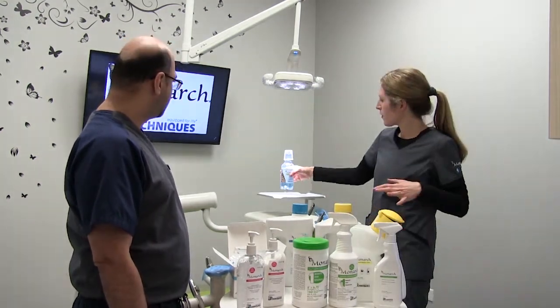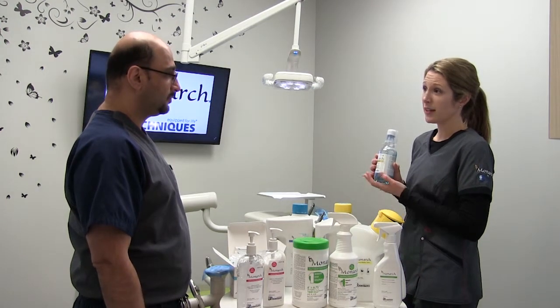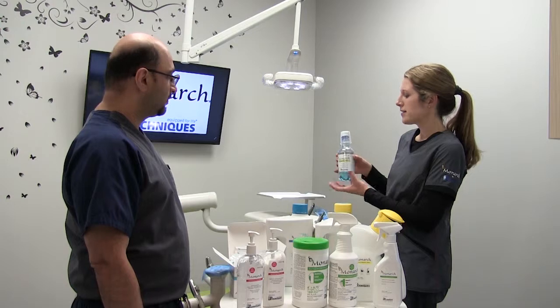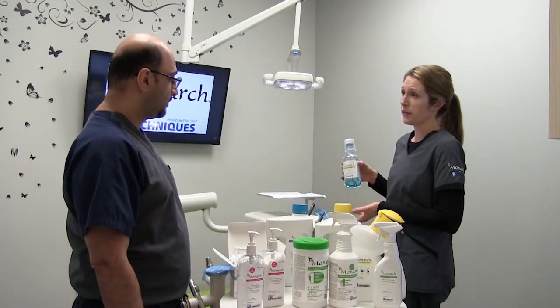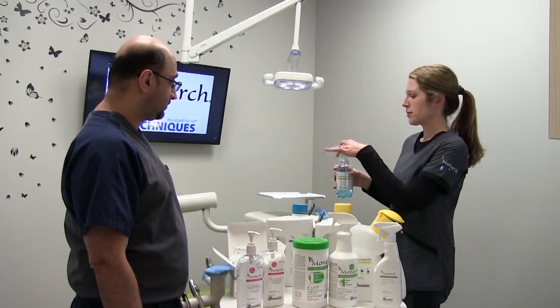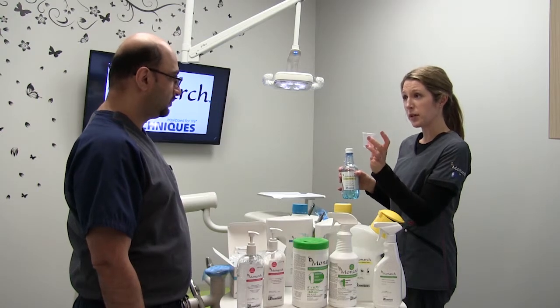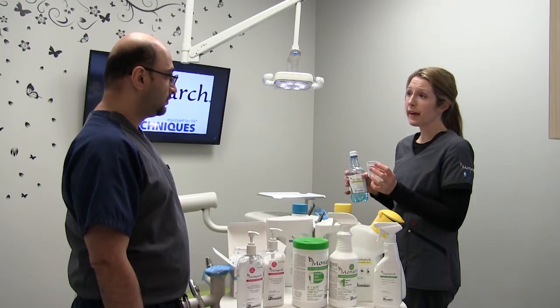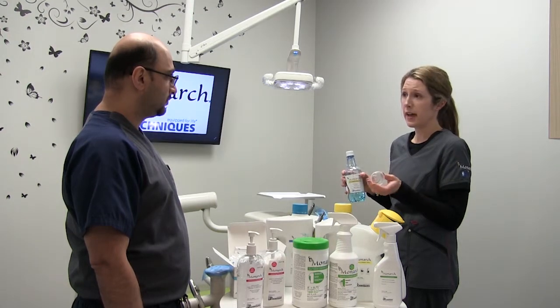For our water lines we have our Monarch water lines cleaner. It was Dental Advisor's 2019 product of the year. It safely and effectively cleans all the biofilm out of your water lines. It's very easy to use — it comes with a measuring cap, and only two ounces of product is needed per use. We recommend doing it every day for the first three weeks and then once a week after that.